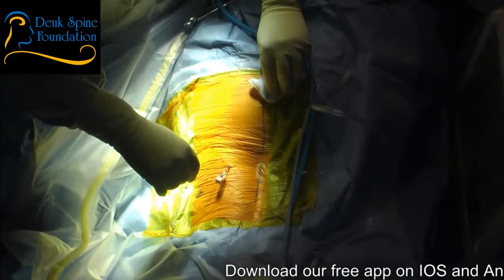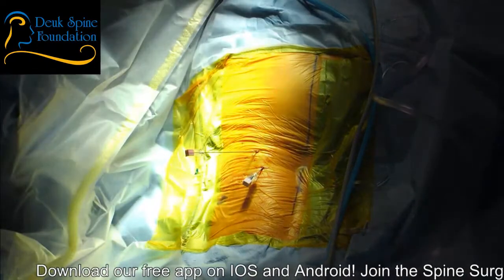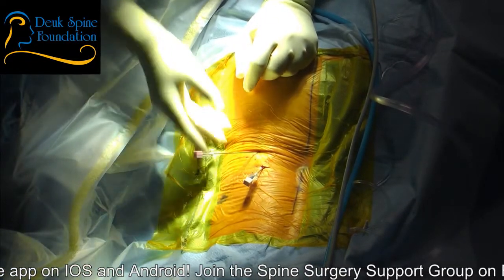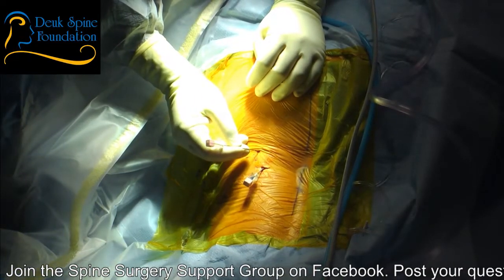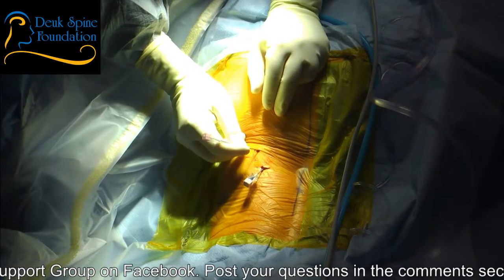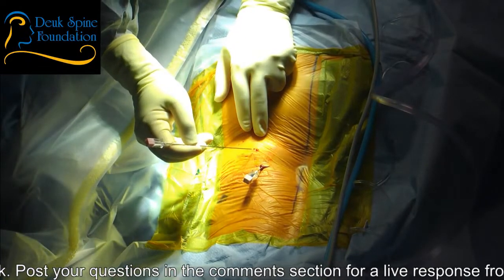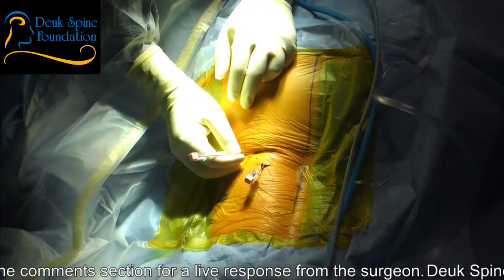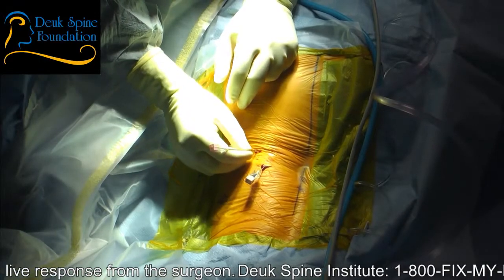We're really north. Besides the listesis, our patient is also rotated — she has what's called a scoliosis of the spine. The important thing here, though, is to appreciate the fact that we're treating her back pain and her leg symptoms from radiculopathy without correcting deformity. So we're not going to be fixing her scoliosis; we're not going to be fixing the listesis. You're doing great, we're almost done — we're going to put you to sleep soon.